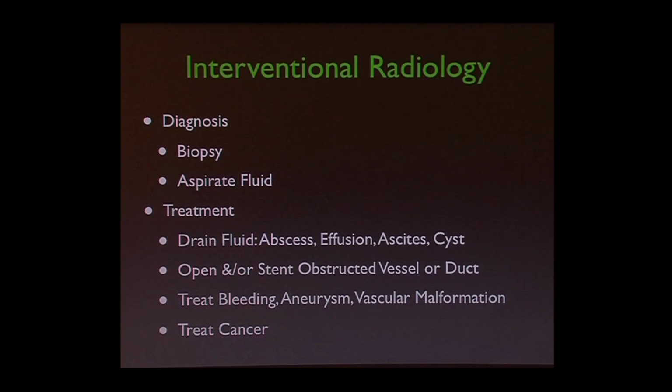All sorts of things have been invented over the last 20 years for interventional radiology, where we do a biopsy or we can stick a needle and aspirate fluid to determine whether something's infected or not, for instance, or we can actually treat it, put a catheter in and drain the fluid, or fluid around the lung called an effusion.